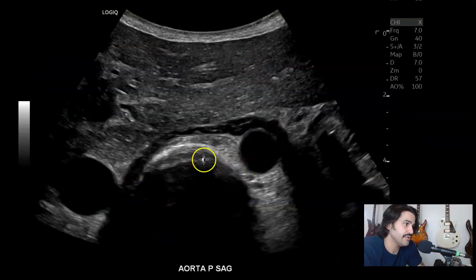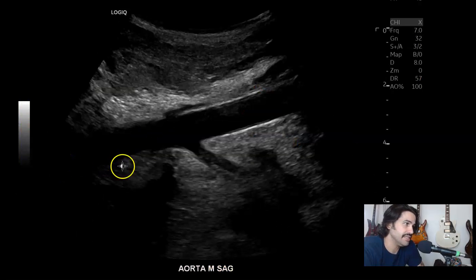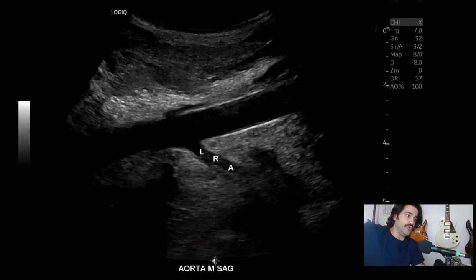Then transverse again — aorta, vertebrae, IVC, and then with color. Then mid — here you got the mid aorta. Now you got the left renal artery. I'm getting a coronal view off to the side, approaching from the right. So the right renal artery should be coming out here in that banana peel sign, but obviously you only see one artery. There's a reason for that — you'll see later on.